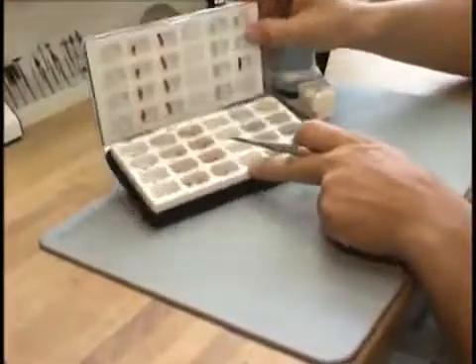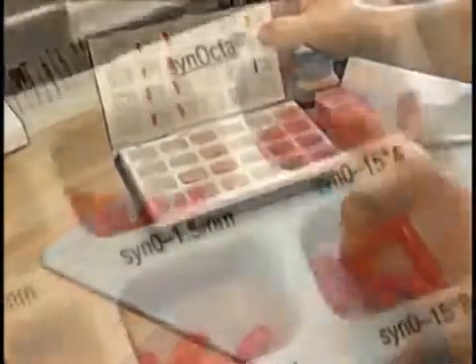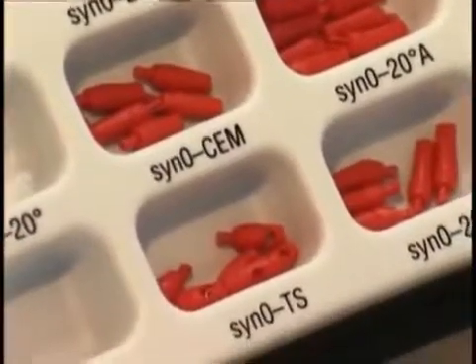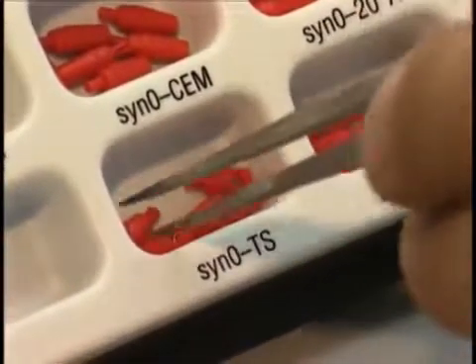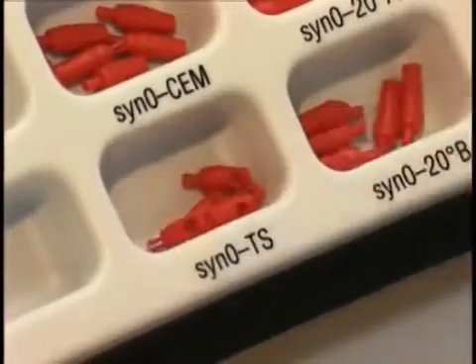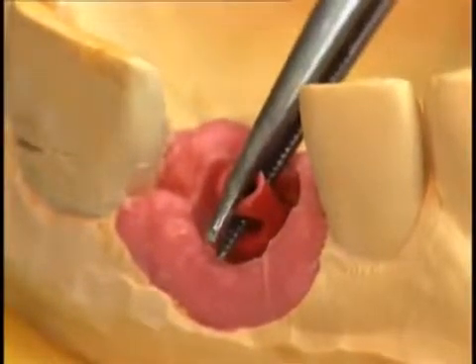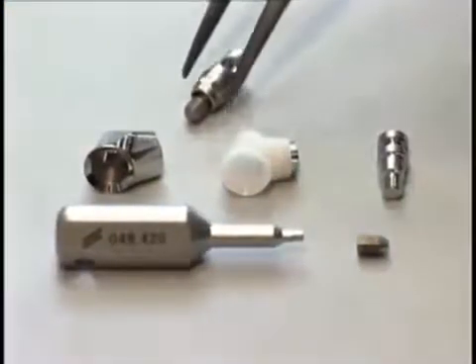For this purpose, a special prosthetic planning kit is available to dental technicians to facilitate the choice of the correct components and to keep inventory levels at a minimum. This planning kit includes plastic try-in abutments for crowns and bridges that can be placed on the implant analogues to verify their heights and axial inclinations.